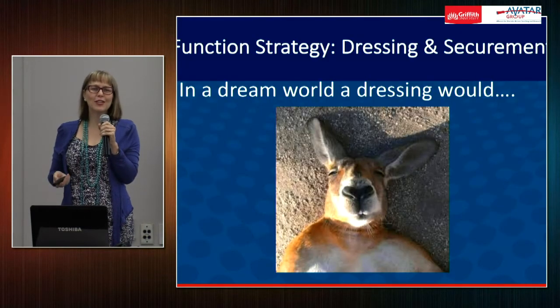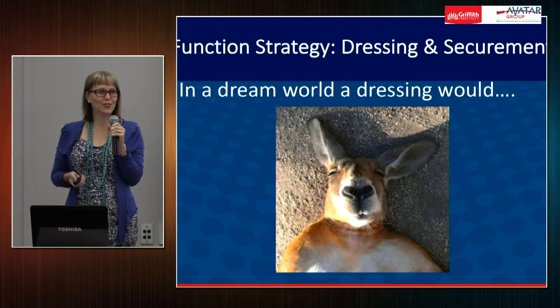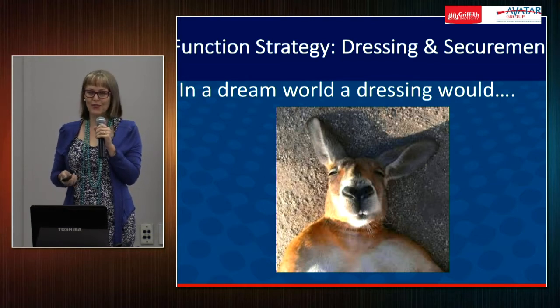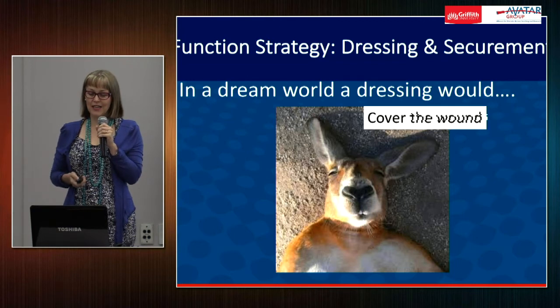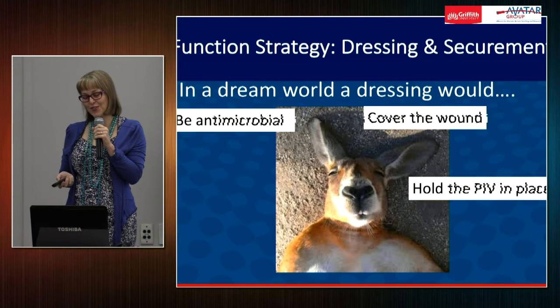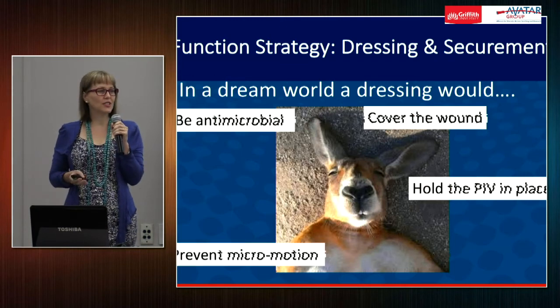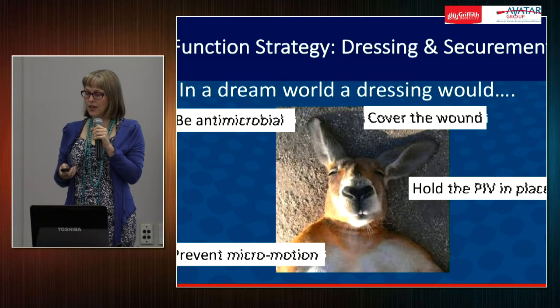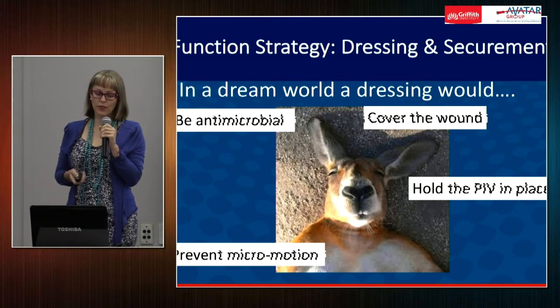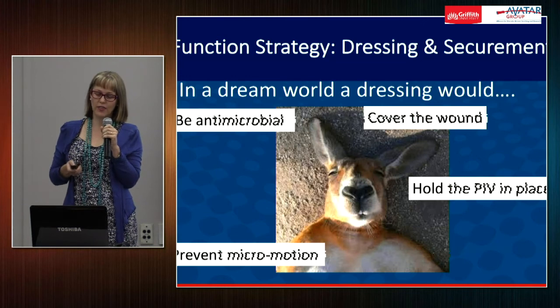We don't really think about dressings a lot, but what do we actually want that little 12-cent piece of polyurethane or whatever we're putting on to do? Well, of course, we want it to cover that hole that is in the person's skin and keep it clean. It'd be quite nice if it actually stopped the microbial regrowth at the site. We, of course, also would like it to stop the PIV falling out. We'd also like it to stop that gentle, small movement that happens all the time as people move their hands or knock their cannula, where the inside of the vein is constantly being irritated by that piece of foreign body in the vein. So we'd quite like it to keep that catheter very rock solid.